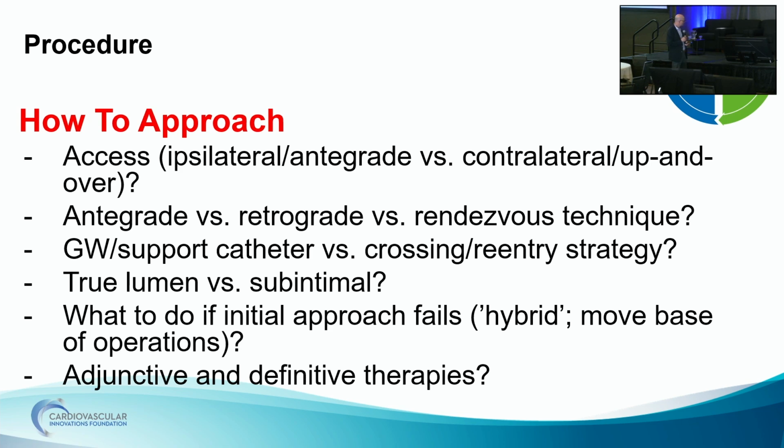I think if he were a good surgical candidate, cardiac-wise, I realize he had CABG, but in my mind that means their coronary disease is fixed. So he's revascularized. If there's still some good vein, if he meets all criteria for a bypass, I would probably try to do the bypass first. Generally that works out well, but as we'll see in subsequent talks, bypasses go down, and you can always try to recanalize the native system later. I would go endo first, carefully, and not do anything stupid.